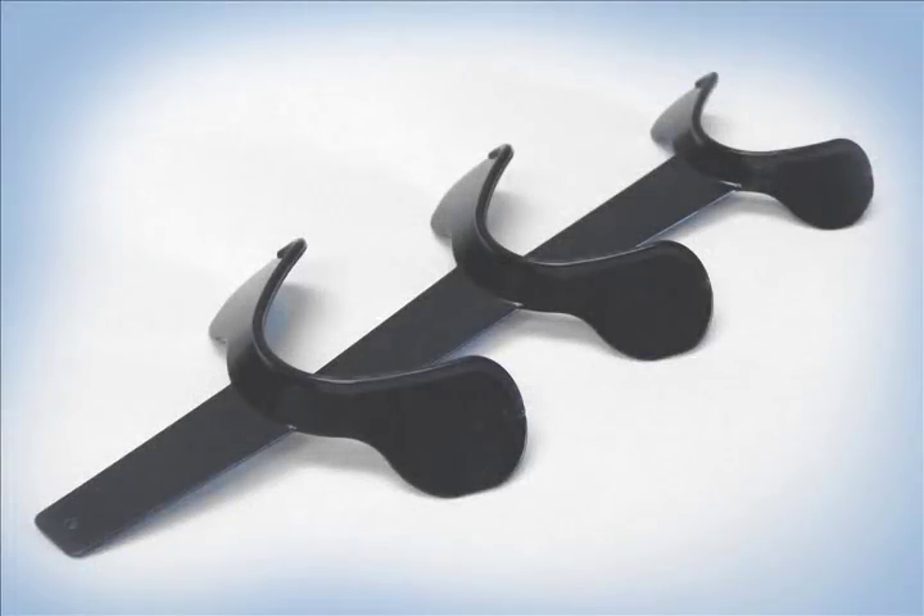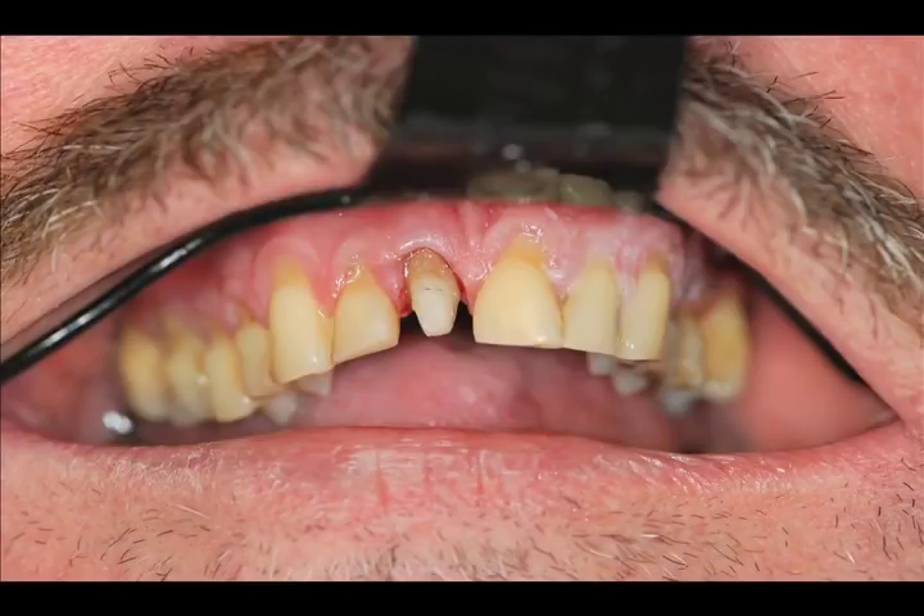A simple tool to use for accurate dental impressions by Drs. Mark Gottlieb and Patrick Retzer. Every year dental products are produced and released that are engineered to make a job faster, easier, and more productive.